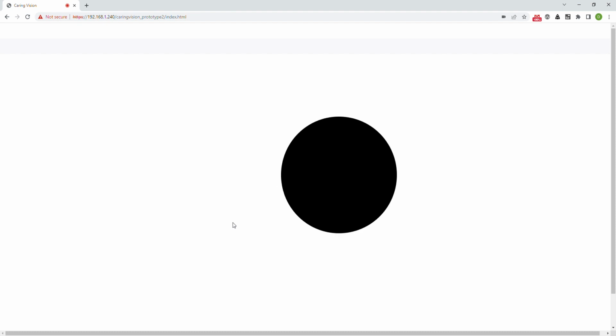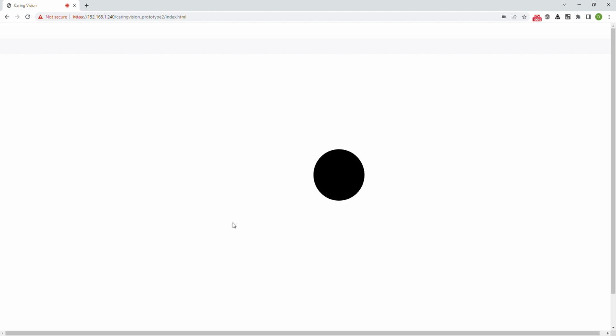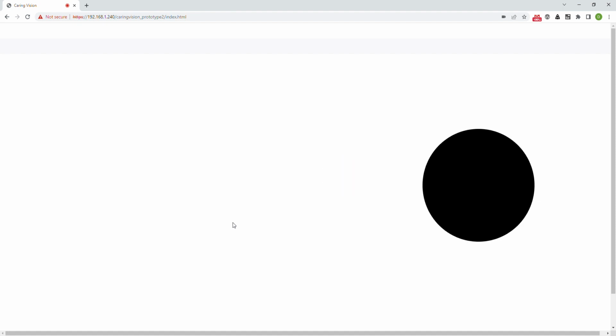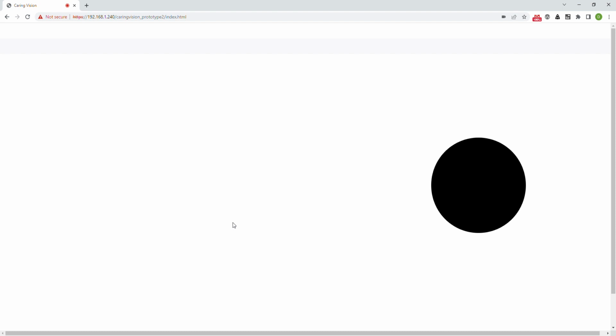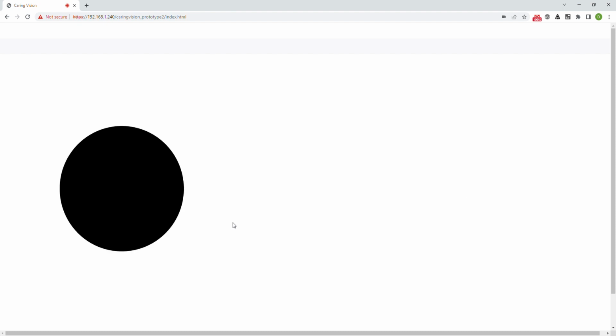So now it's got an idea of the accuracy for all areas of the screen, and what's happening now is refining that accuracy. Again, as I look away, in that case I'm not actually looking quite at the black spot, so it turns red. That's a much more eye-catching colour, so I'm more likely to look at it. You'll also notice that when I'm not looking at it, that spot becomes bigger as well.